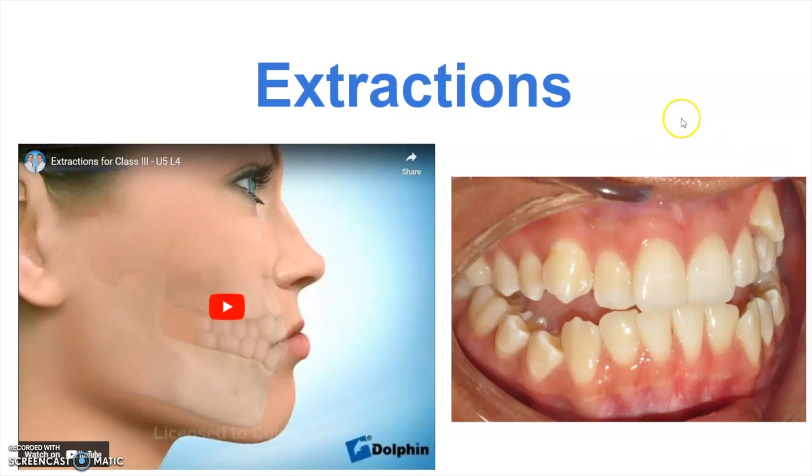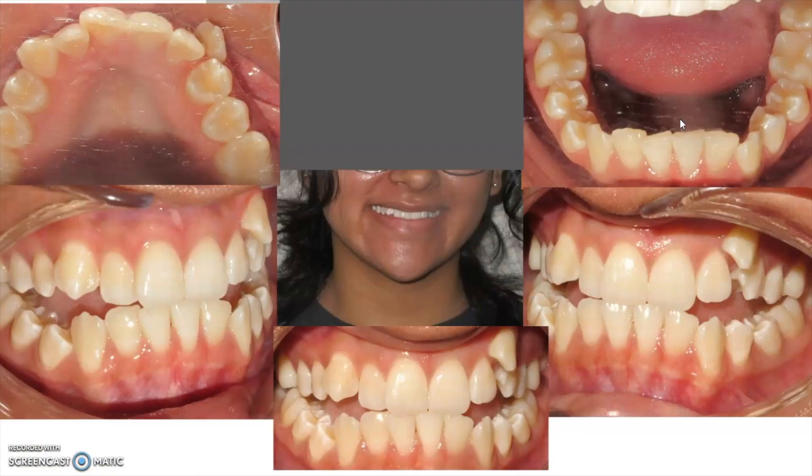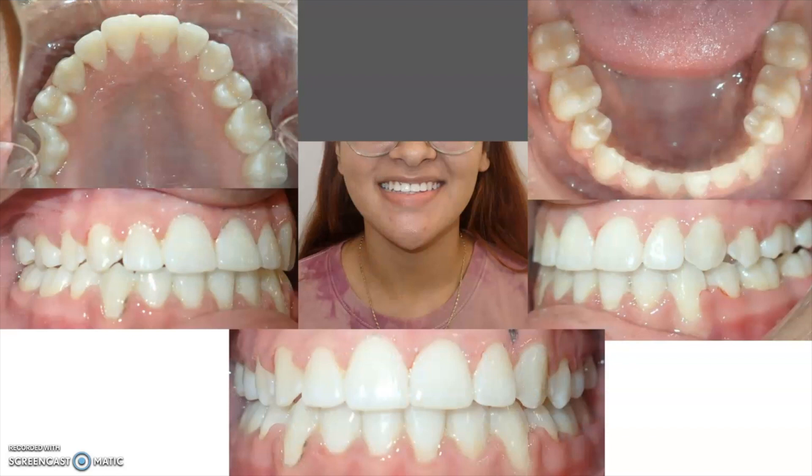She had about two years of braces. Here is her starting photos — you can see how much crowding she had as well as the bite problems that she came in with. And here is after treatment was completed. She has four less teeth: two teeth were taken out on the top and two on the bottom as well. By the time we're done all the spaces are closed, no one can really tell the teeth were removed. You can see everything is nice and aligned and you can see how much better the bite is where now the teeth fit together like they should.